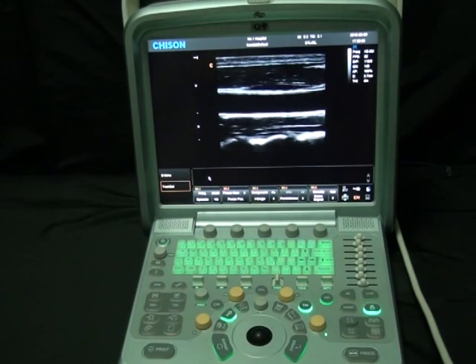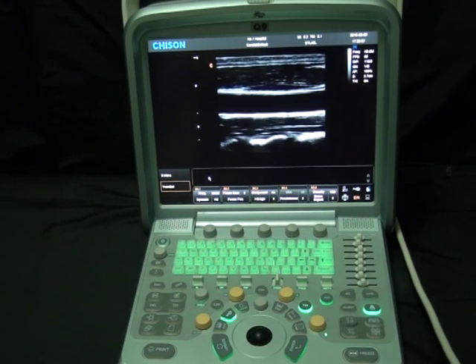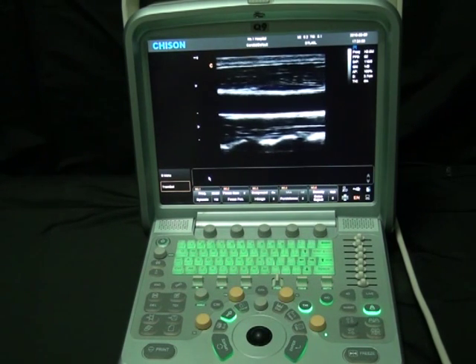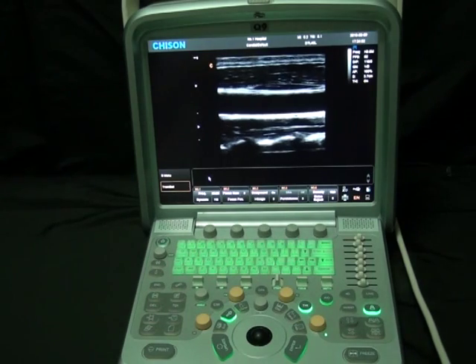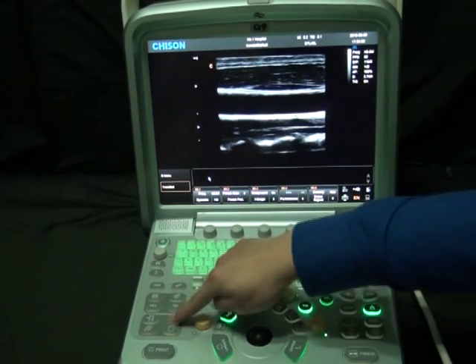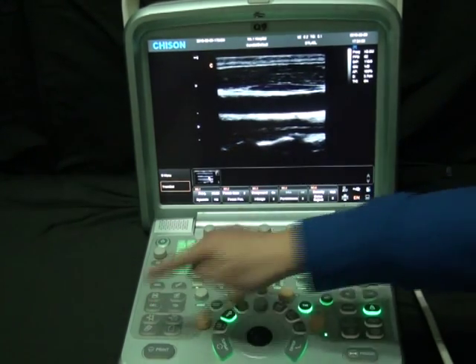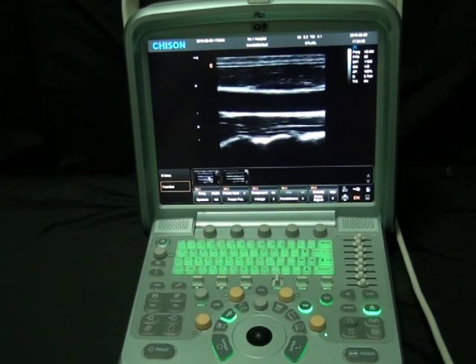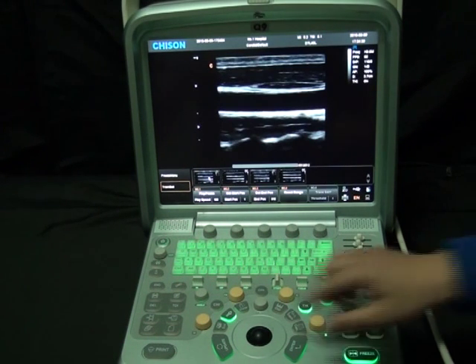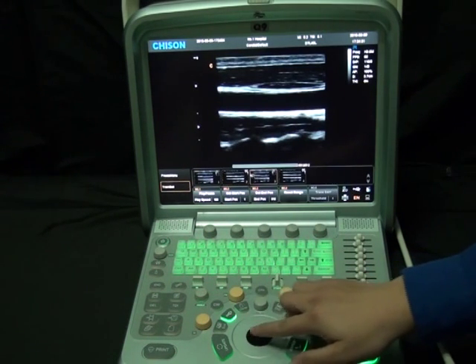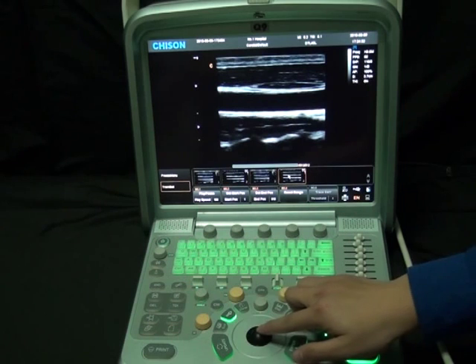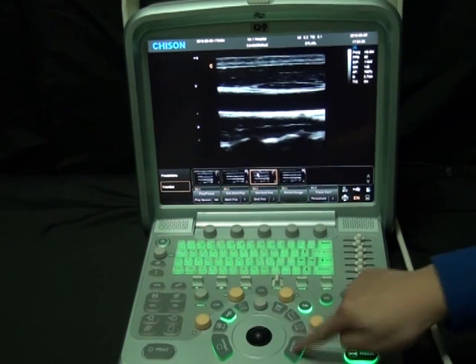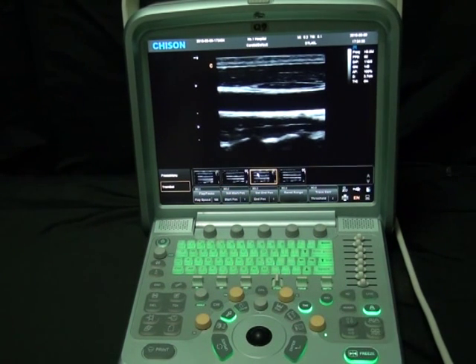After the image is ready, what we need to do is save images. Press one key to save the image or the cine. We can save both images and cines in real-time and in frozen status. If you want to recall, use the cursor button, move the cursor to the image or cine of interest, and click Enter.